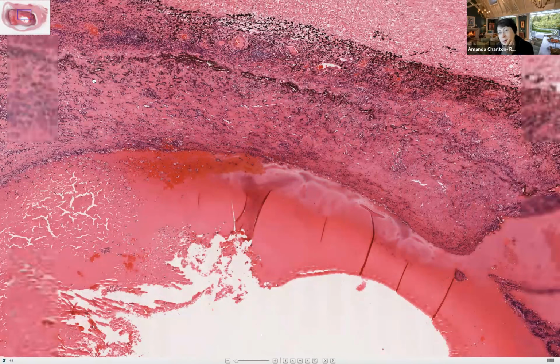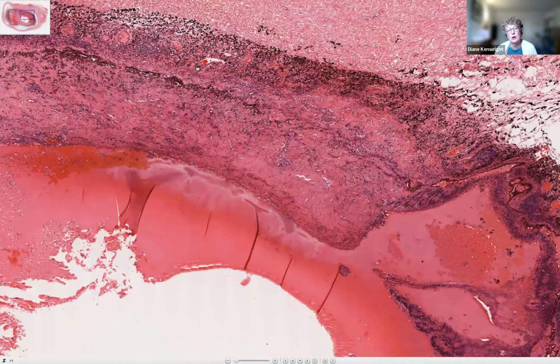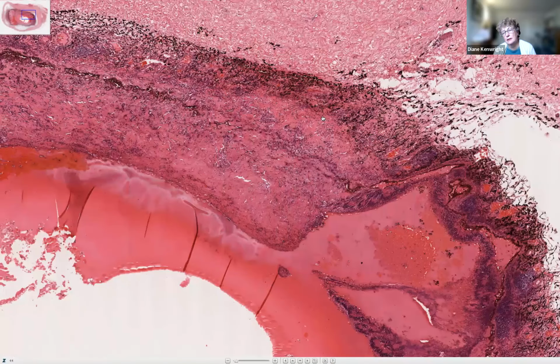All right, so Diane, where do you think the original layer of the RPE is? Could you take your cursor along here? I think this is old choroid. Yep. That has got lots and lots of inflammation in it and blood vessels. And I think this is old RPE. And, right, you know, there should be a retina up here, but really there's not. Yep. Got it. As we move around, we do get some retina, and you can see this RPE line continuing around, looking slightly more normal.